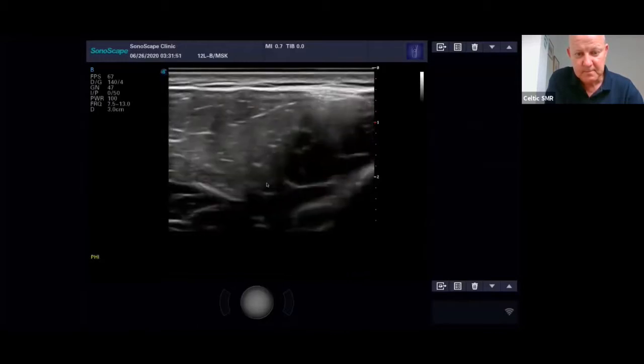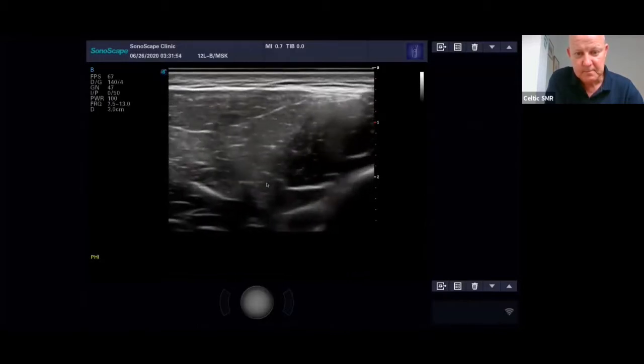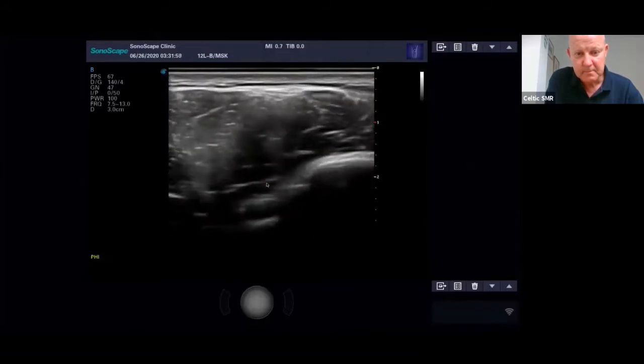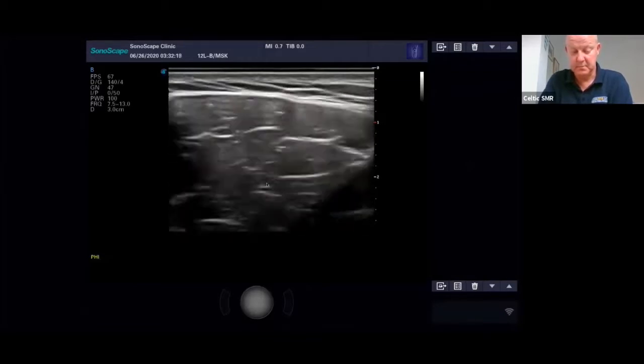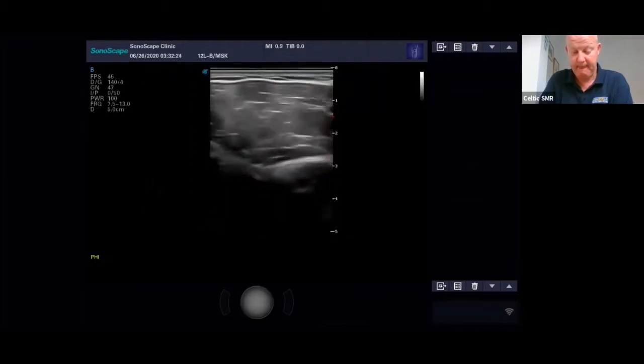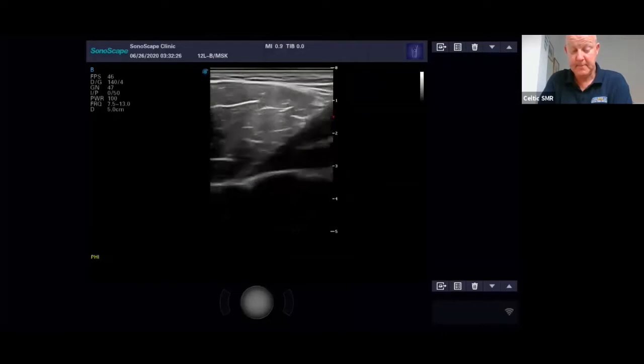Okay, now I tend to scan the shoulder standing behind the patient. You can scan anteriorly, and sometimes when you're first starting out, it's quite nice to scan anteriorly. I don't know whether I can turn you around now, just to show that. So if you bring your legs around this way, okay. Let's check the depth down. So you can scan anteriorly.